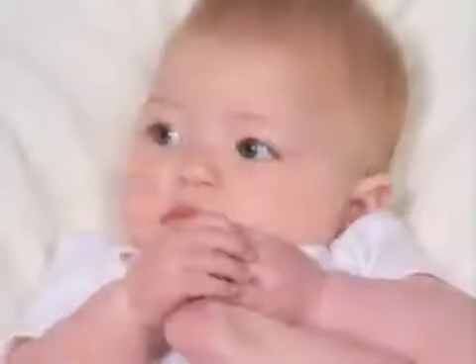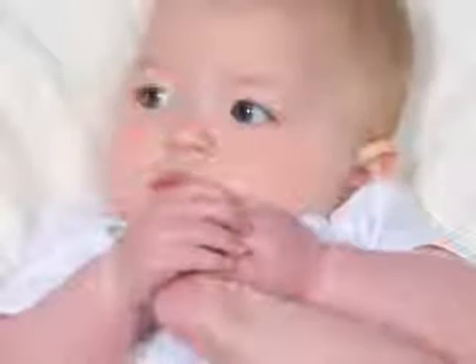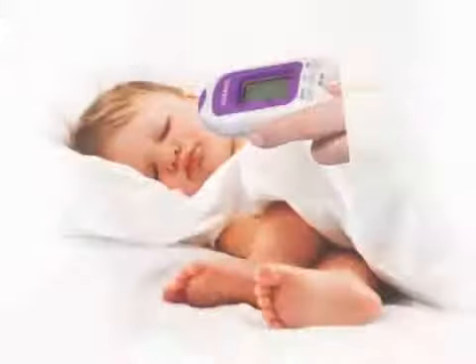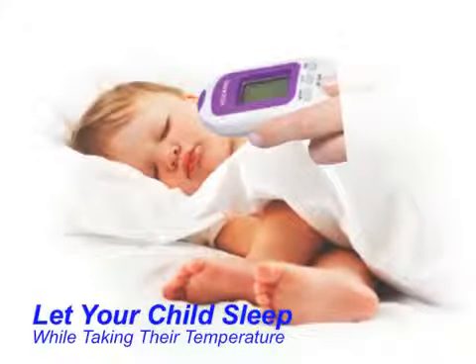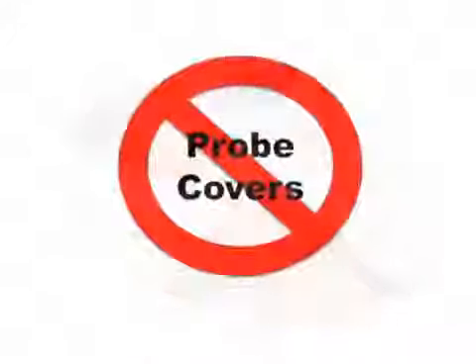You want to know if your child is sick. The Veritemp makes it easy to keep your family safe, happy, and healthy. Non-contact means that there is no need to wake, startle, or upset your child while taking their temperature, and there is never any need for messy or expensive probe covers.